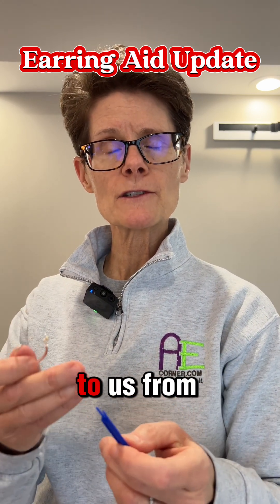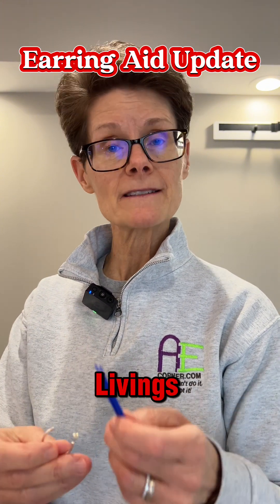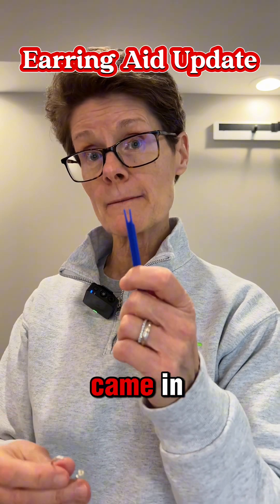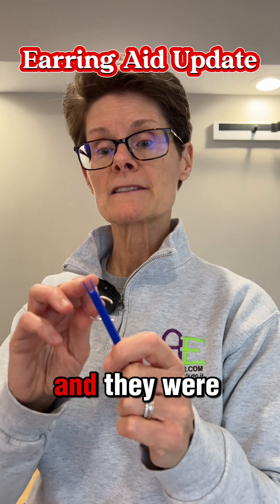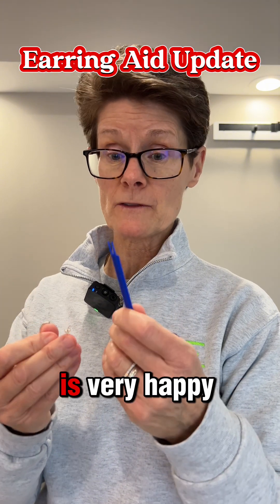We had a person reach out to us from the Western Wisconsin Center for Independent Living. They have a Makers program — they're getting up and going — and they had a customer that came in asking about these. They were able to make one for them and he said it worked great. Their customer is very happy with it.